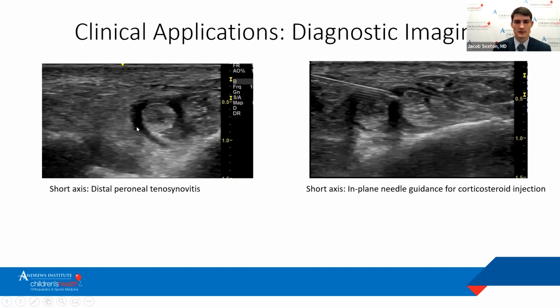When you see it circumventing the entire structure, then you start thinking of pathologic features, and particularly in the peroneal tendons, most classically is peroneal tenosynovitis. If you look very closely here, this is what the normal fibrillar architecture should look like. So it's more isoechoic, understanding this is a still image, so I would need to see the whole video again to confirm. But when you see this, you get concerned about a possible split tear, because I have a hypoechoic element within the middle of the tendon.